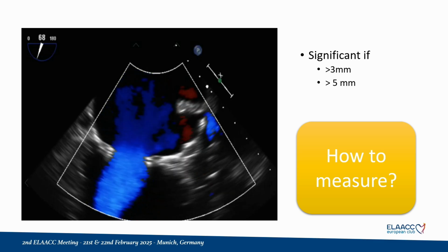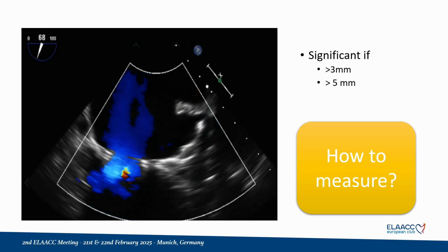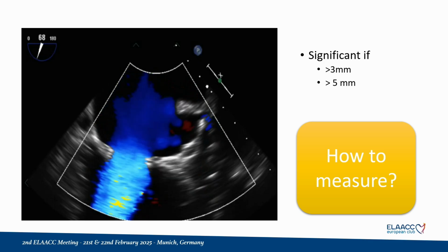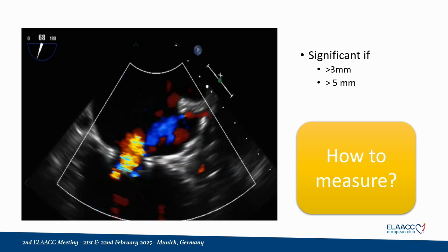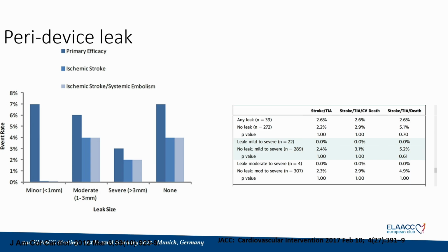And the other thing is that now that we are talking a lot about CT, 3D and so on, what is the best way to measure these leaks? Because I think that we need to put something in common for the future studies. The other thing is that what we know about the influence of the leaks on the follow-up of our patients is also not so clear, because in most of the studies, even leaks that are smaller than the larger leaks have more impact in follow-up.